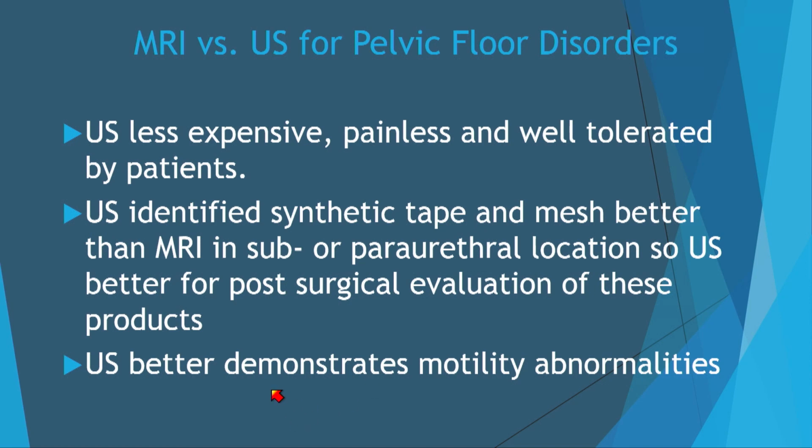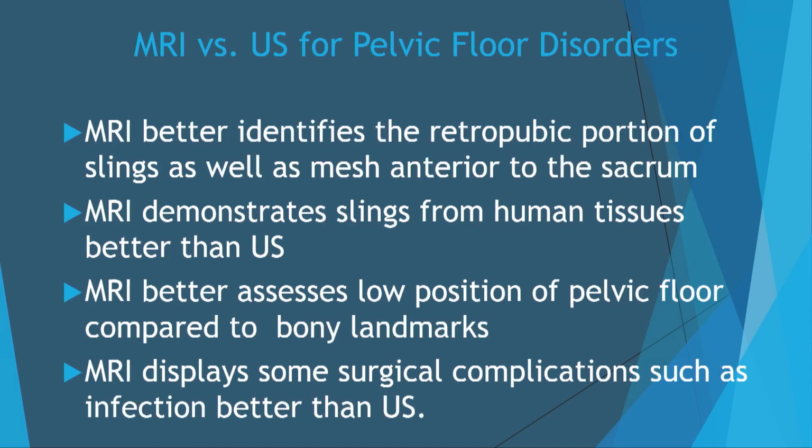Furthermore, ultrasound is better in identifying movement. So if you have some kind of dysmotility, as I've shown you in the slides, ultrasound is an excellent way to show that in real time. But MR definitely has a place in pelvic floor disorders, and what we found in our experience is these are the areas that we particularly like to do MR.